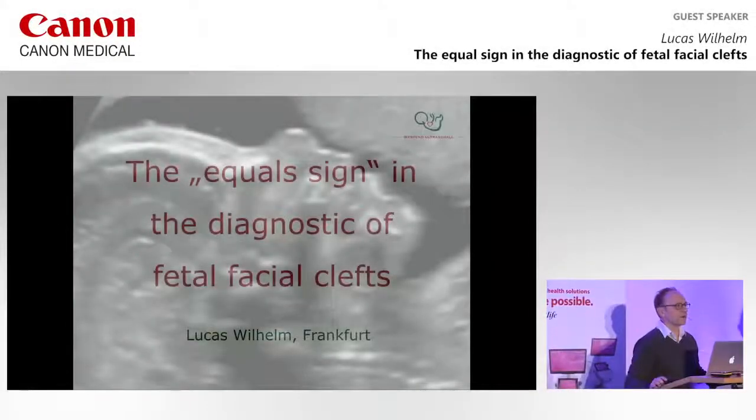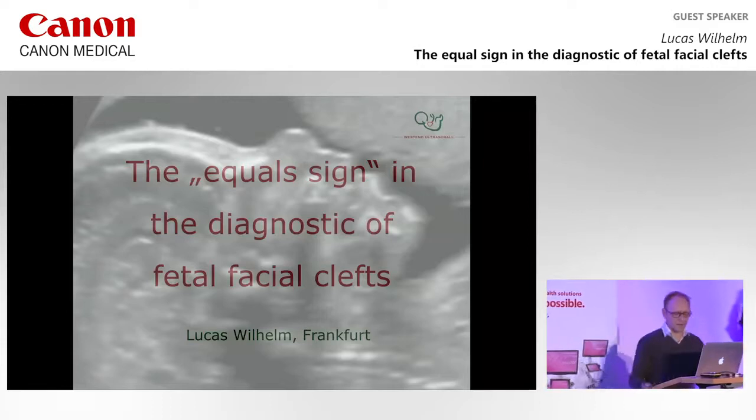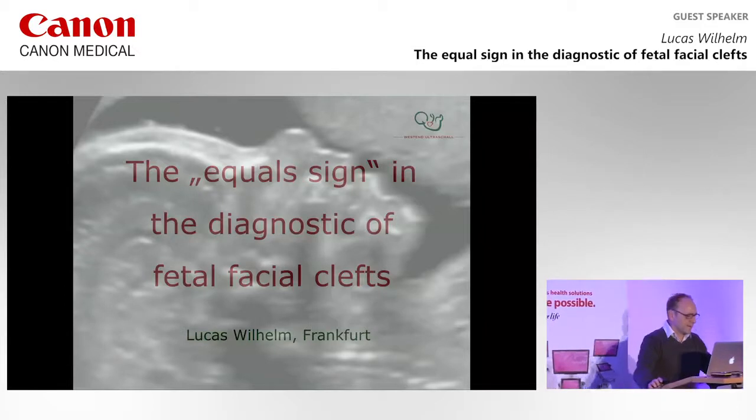To be honest, I'm very, very excited. And I want to tell you in the next minutes something about the diagnosis of fetal facial clefts. With an incidence of about 2 in 1,000, fetal facial clefts are one of the most frequent congenital malformations. So it's very useful to be able to handle them.